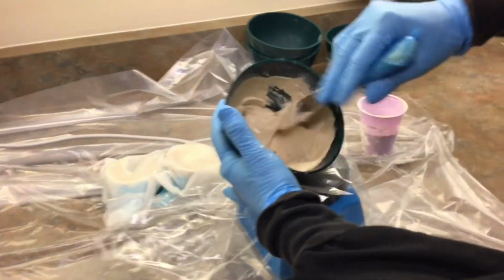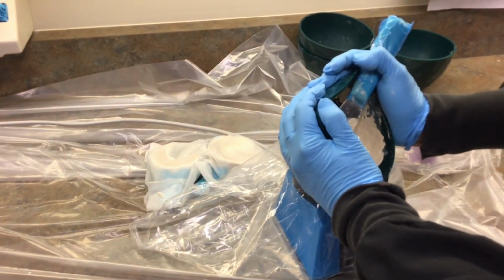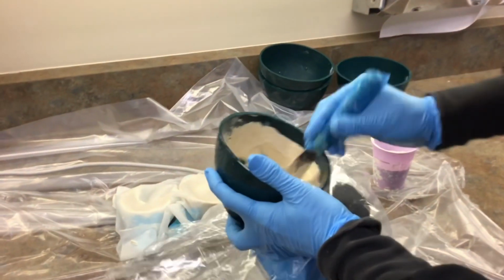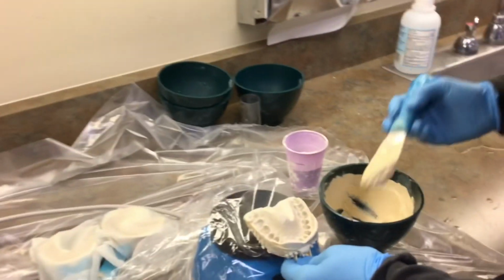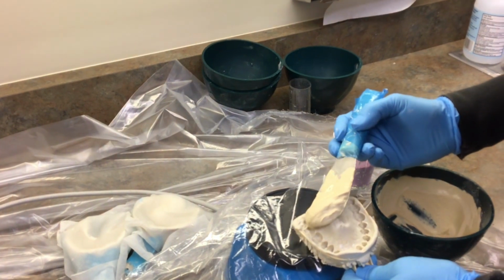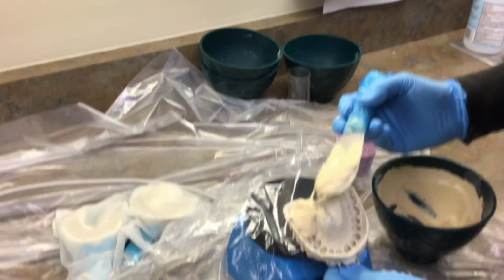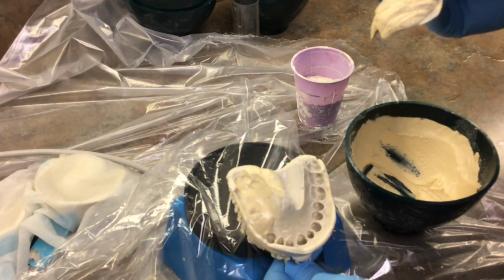So you're gonna mix it. Make sure the bubbles are all off, which they pretty much are. Then, wherever you're gonna start, which I always start at the back, I'm gonna roll it. So you're gonna put it in and let it roll. Try to show. Now it's rolling in. See how it's slowly going into the teeth, slowly?